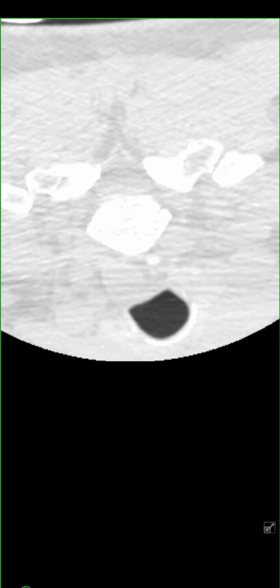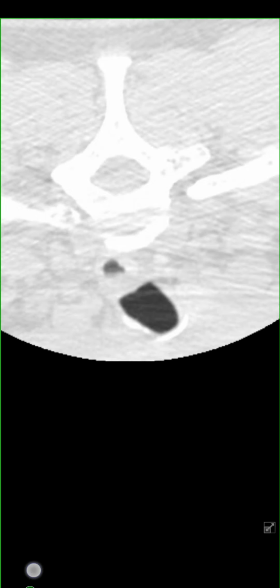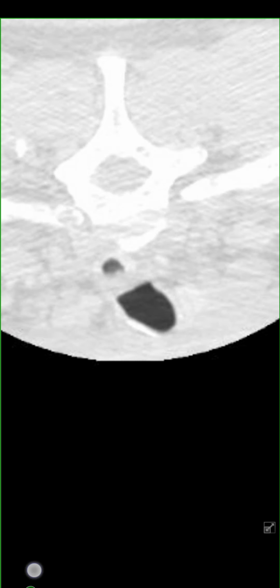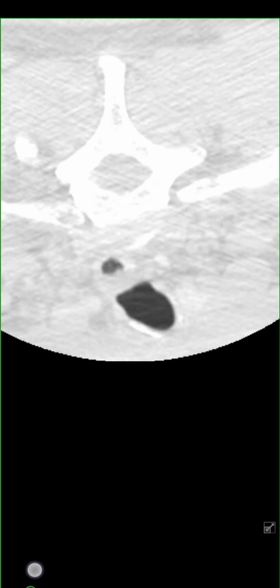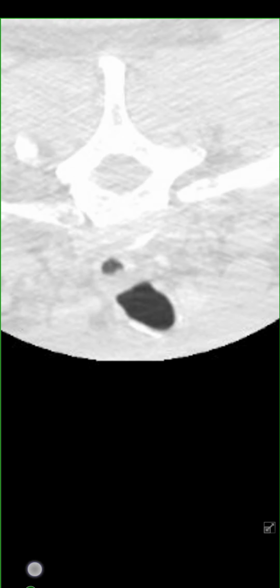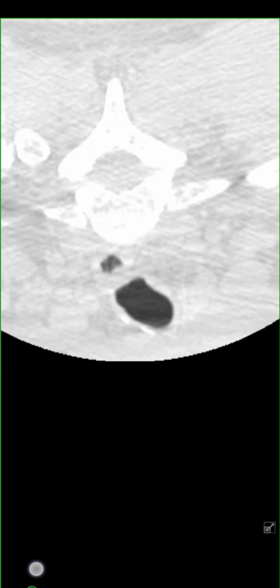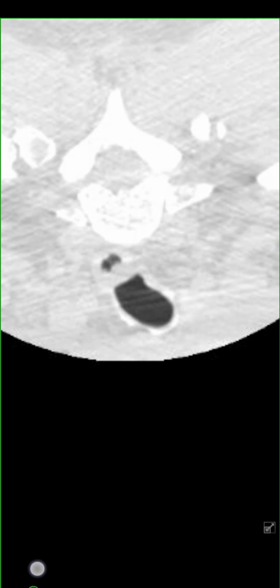The area at the bottom is my trachea, which you can see is relatively clear, slightly misshapen. And the dark area above it is my esophagus. Now, normally, when a radiologist sees that type of air in your esophagus, it means you have GERD or reflux or maybe even a burp. That certainly isn't the case in my situation because it's always there. I always have that feeling of air in my esophagus, and I am relieved when I burp. However, it comes right back.